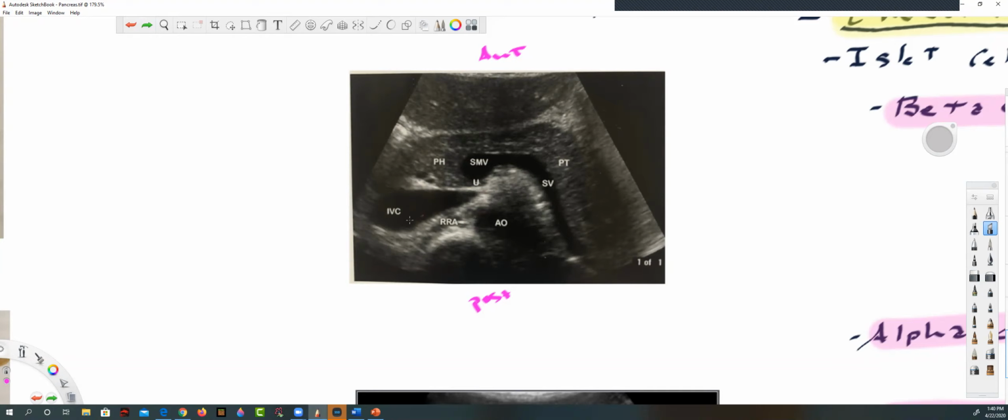Oh, and look here, the IVC is shaped like this. Well, it's being squeezed out. It is a vein after all, but we don't see it, but trust me, it's there. That is the left renal vein, coming from the kidney here, and going up and over and into the IVC.